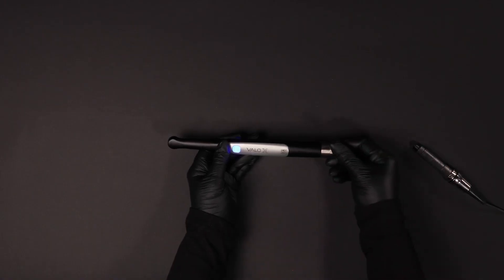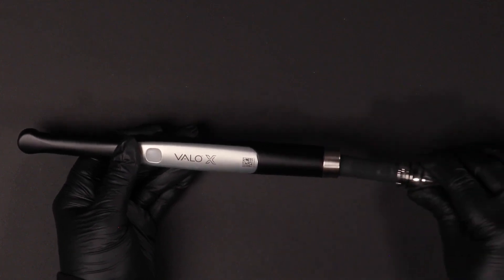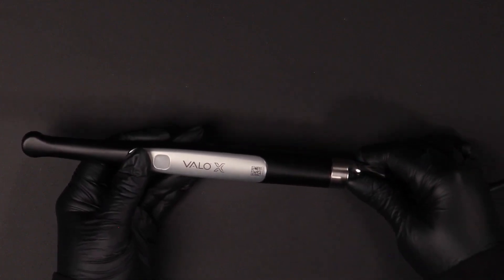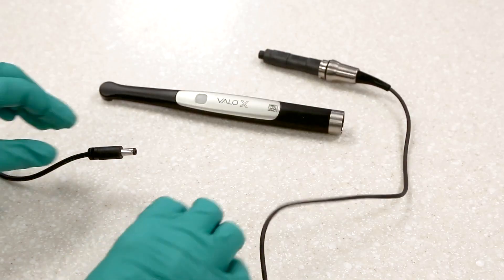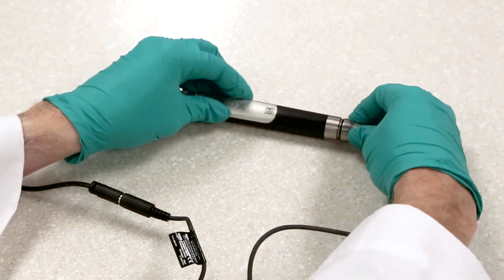To use your VeloX light with the included cord adapter, remove the back cap and remove the battery. Insert the cord adapter and secure with a clockwise turn until it stops. The power supply is a shared component for the battery charger and the cord adapter. Position the power supply where it can be easily disconnected.